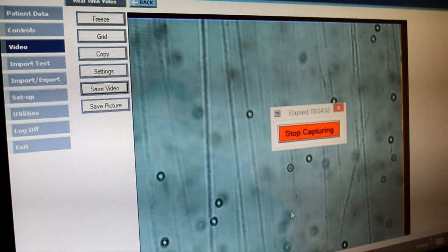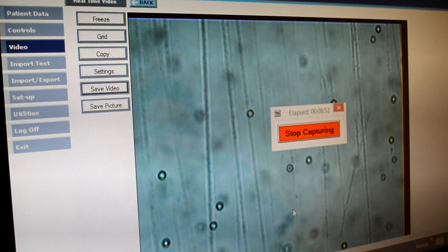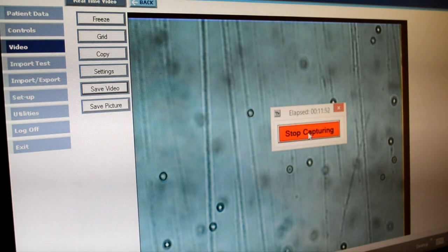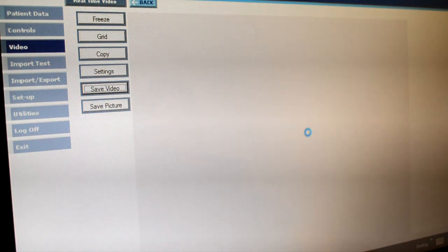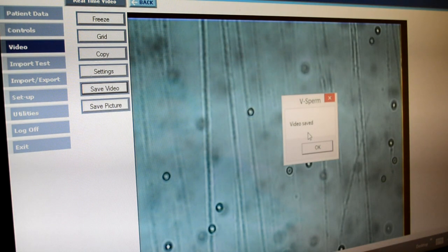We generally recommend 10 to 15 seconds in order not to fill up the entire memory. Stop capture discontinues the recording, and the system will again confirm that you have a clip of your sample saved.